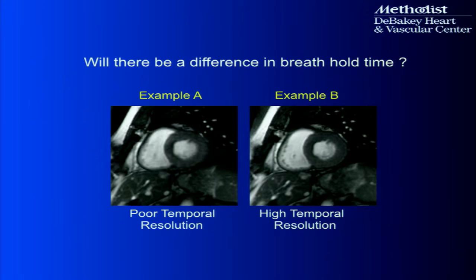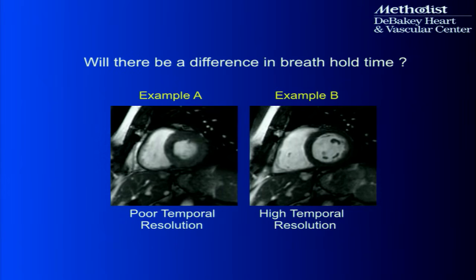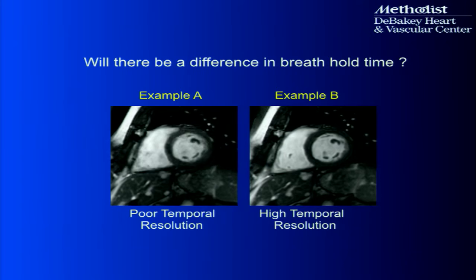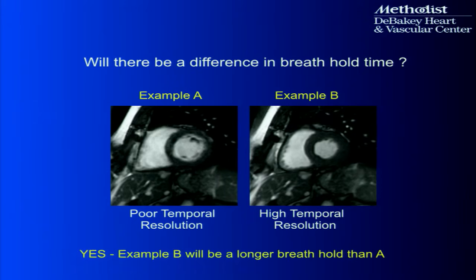And so the optimal frame rate for any patient is whatever the highest rate they're able to tolerate, right? Because it doesn't make sense to try to go for an ultra high frame rate like on the right-hand side if the patient can't tolerate that, they can't hold their breath that long. And I'll show you now what happens then.